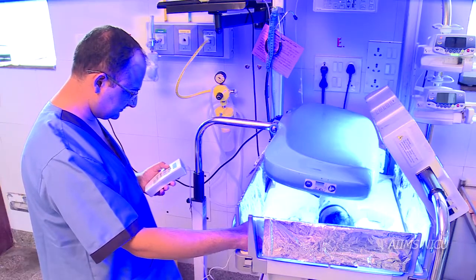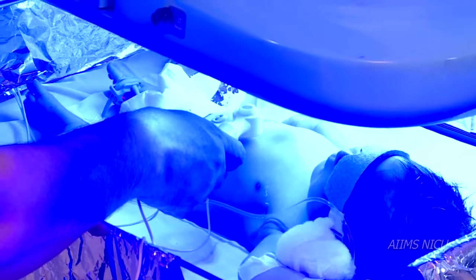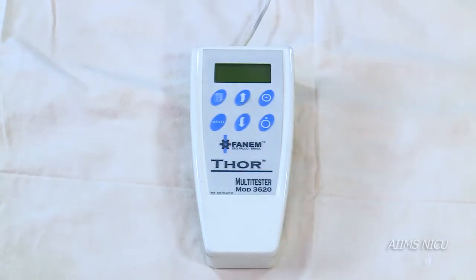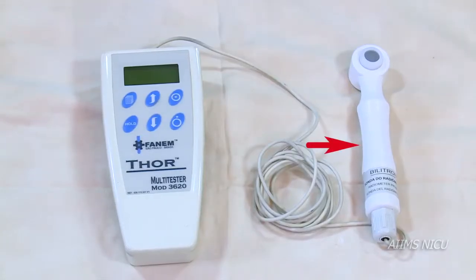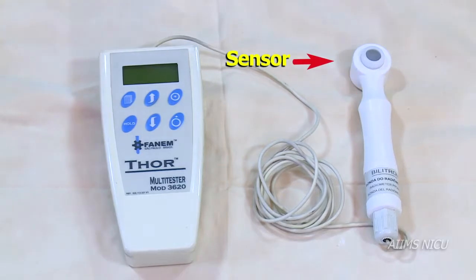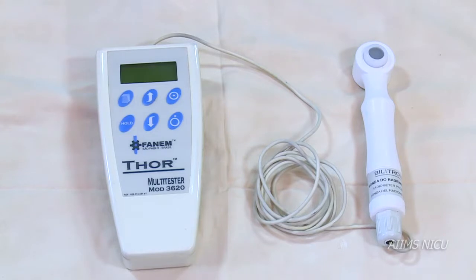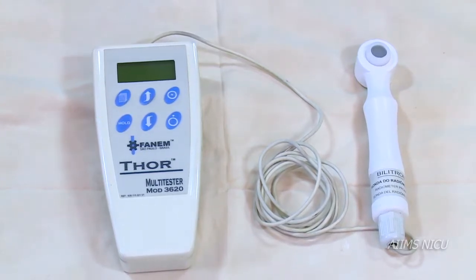In this module we shall be discussing the utility of a flux meter in preterm neonates receiving phototherapy. A flux meter, or irradiance meter, is used to measure the irradiance of phototherapy units. The flux meter is small and handy, and consists of a sensor to measure the irradiance in the desired wavelength and a display unit to show the output.